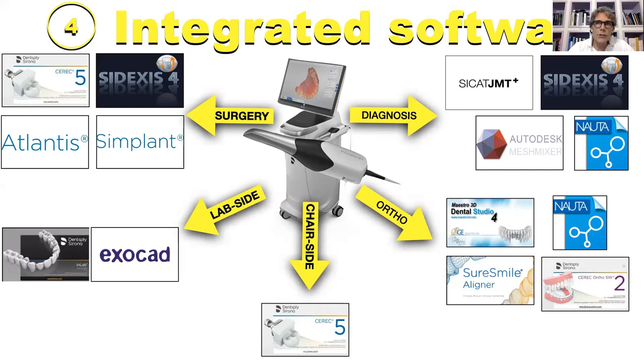Again, I use my Cerec, my Primescan in a complex case in which I have to modify a lot of things, such as vertical dimension of occlusion, or incisal guides or canine guides. In these cases, when I have the support of a dental technician, I share with him the impression made by my Primescan, and he will be able, following the same digital concept of work, to design the final restoration using different software such as inLab 20 or 19 and Exocad.